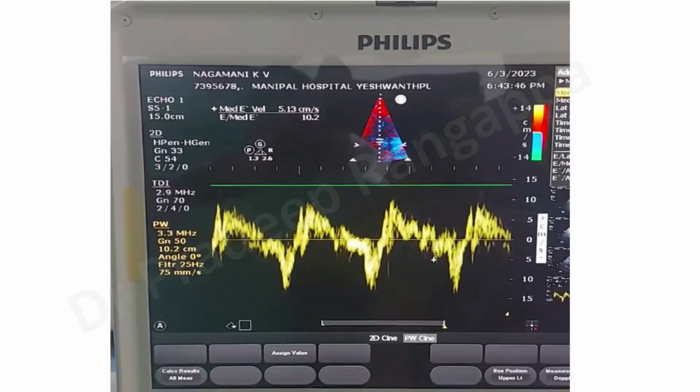So in our practice, for every patient in ICU, we expect our trainees to do a diastolic function assessment, which only takes two to 3 minutes, and filling pressure to rule out diastolic dysfunction. So the message is, any intensivist who is dealing with a lot of fluid or a sick patient, please do a diastolic function assessment for all your patients and at least rule out any diastolic dysfunction, because if the filling pressure is high, you have to restrict fluids and address the diastolic dysfunction and mitigate the whole conundrum that will happen with fluid overload. So that's a very brief overview of diastolic function.